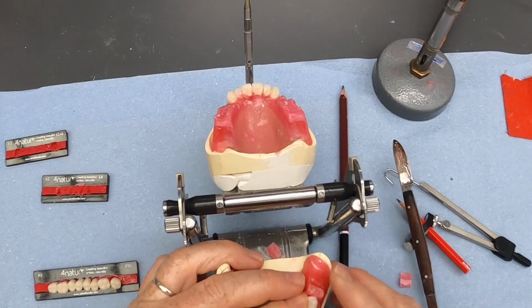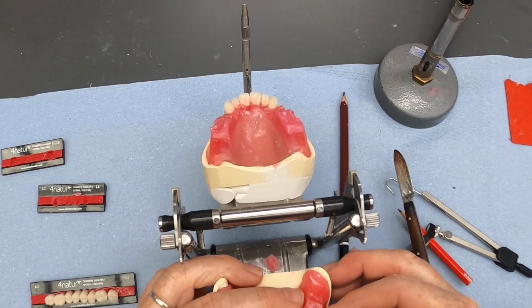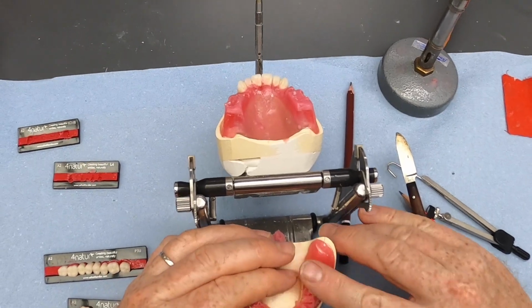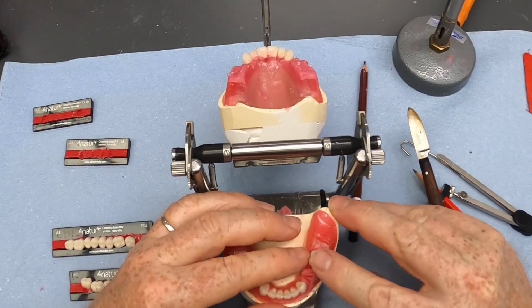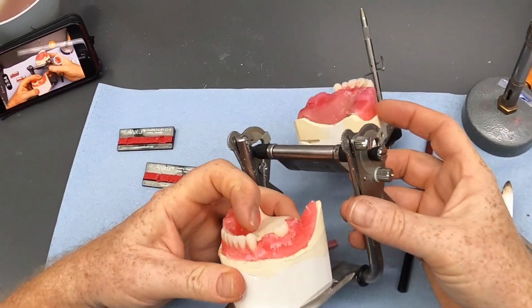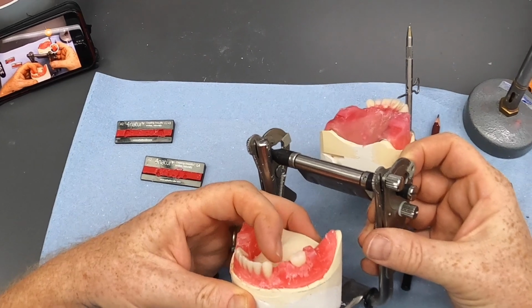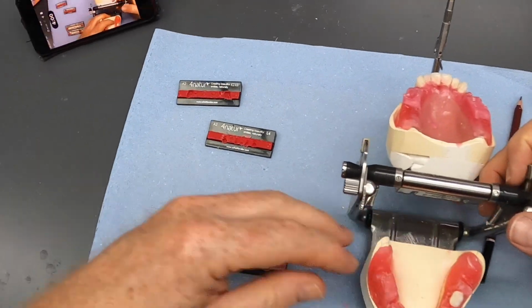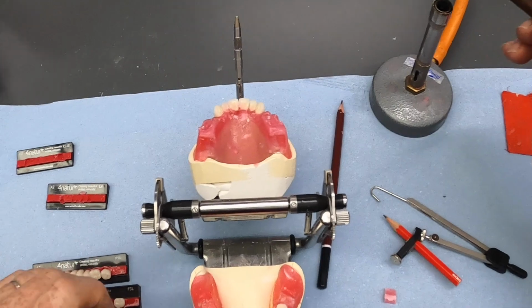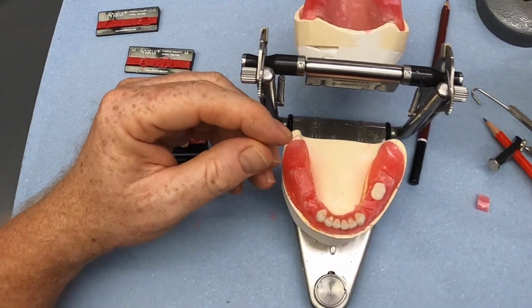So I'm lining my tooth up with the mark at the back, with the mark on the side of the model, and we're getting those cusps even, the buccal and lingual cusps even, and then you can see we're at the level of the occlusal plane as well. And then we're going to see if our premolars fit this gap. If not, we'd probably want to get a smaller or larger tooth depending on how we get on.